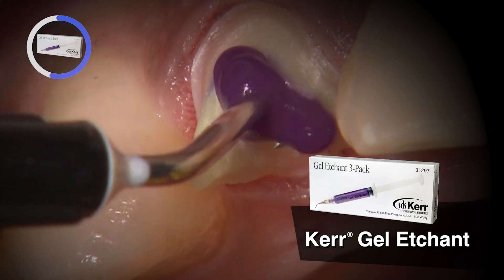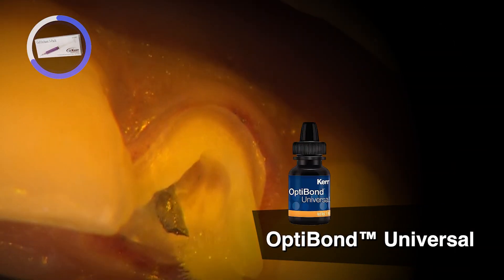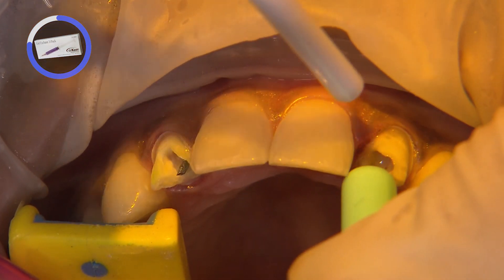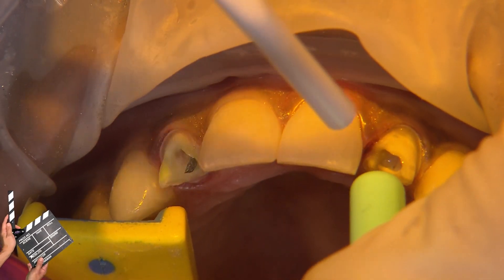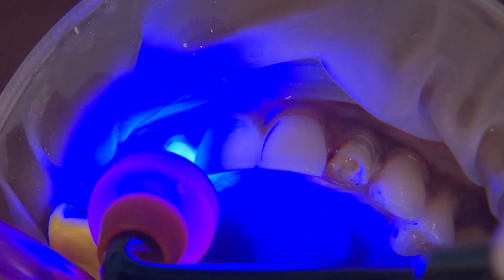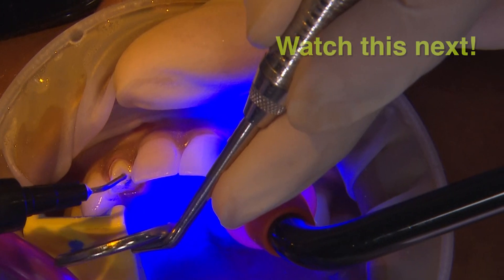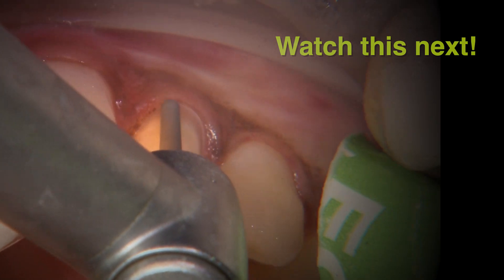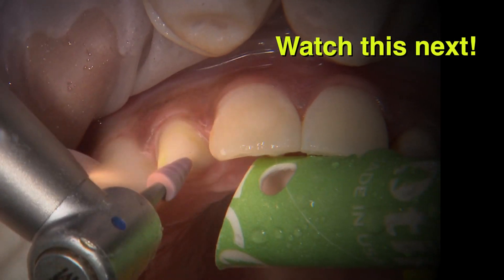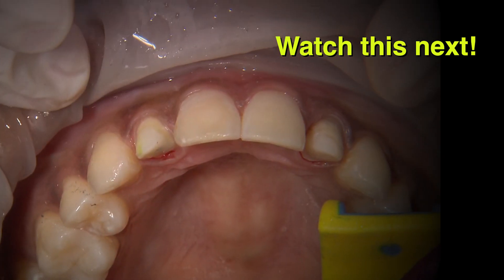Now to start the buildup, I use Kerr's 37% phosphoric acid etch for 10 seconds, followed by Optibond Universal. After I apply a bonding agent, I always use air and suction to remove excess bonding agent and also to evaporate the solvents. Once the bonding agent has been light cured for 10 seconds, I incrementally use camouflage nano-hybrid flowable composite so the buildup is well adapted to the teeth. Once the buildups are cured, I'll continue refining the preps to ensure that there is adequate reduction and the internal surfaces are rounded and smooth.